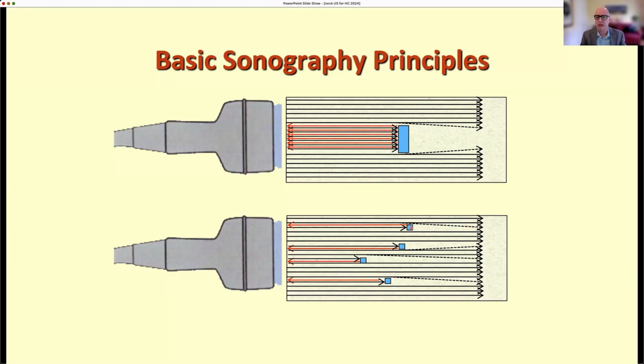And we'll see how this is particularly important in the thyroid because we see little objects like small calcifications that can generate a very bright signal and at the same time do not produce a shadow. The density of the crystals is important in determining the shadow, and because of that, the shadowing or non-shadowing property of obstacles is relative to the equipment that we use, meaning a single object like this may generate a shadow in one ultrasound machine of some brand and may not in another brand.